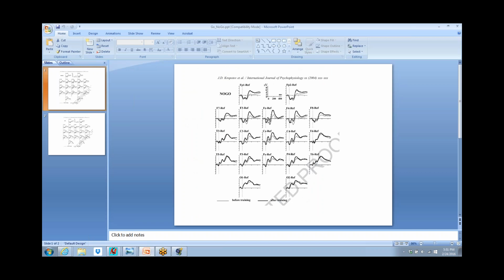So what everybody, I hope, just saw. Hang on, Jay. What I'm hoping that everybody just saw was the difference in time that it takes to process this information. As Jay said, this is a sequence, and you can't see this on a raw EEG. So there is a real relationship between EEG and event-related potentials, but you've got to know what you're doing to see it. Yeah. And okay, so that was the part I wanted to emphasize.